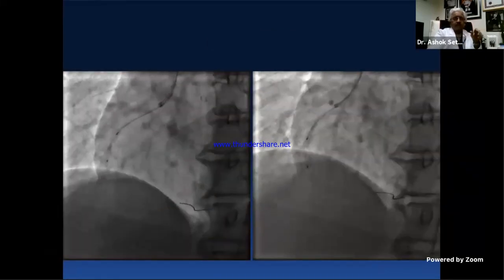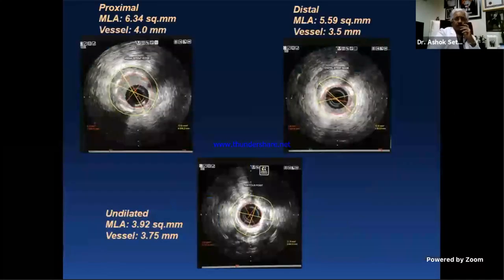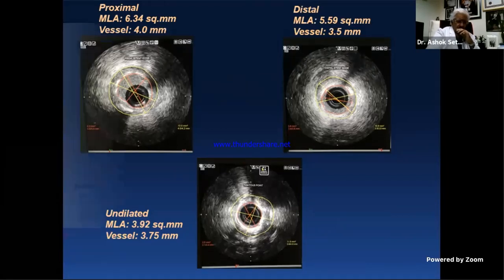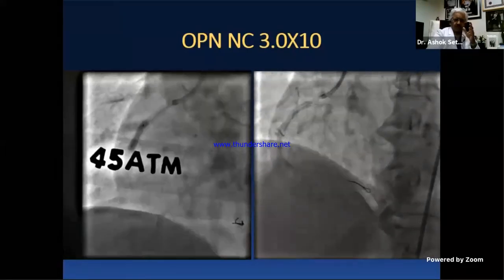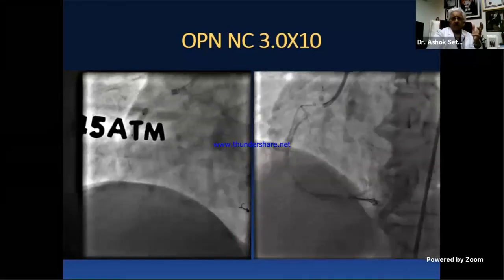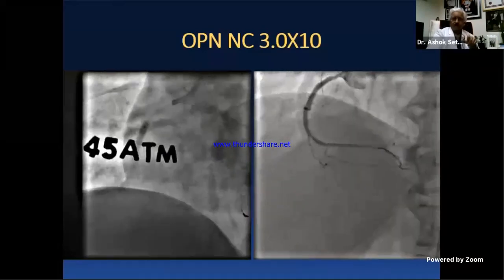For all under-dilated lesions, we have two options now. This is the IVUS catheter, which doesn't go in at first. After taking away some of the restenotic fibrous tissue, one is able to image this, and it's clearly a circumferential calcification with marked under-dilatation and under-stenting of the vessel, with luminal areas inadequate compared to the vessel size of 4, 3.5, and 3.75. Of course, we talked about the ultra-high-pressure balloon, but here are the advantages we now have. We could either use intravascular lithotripsy in such situations or the ultra-high-pressure balloons, which gives us the advantage of going to very high pressures. And here's a 3.5 millimeter vessel.